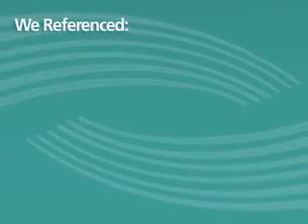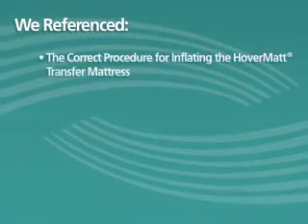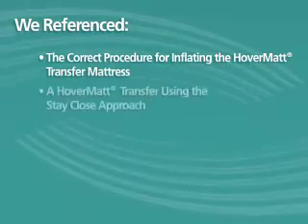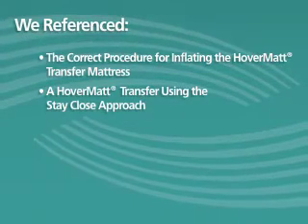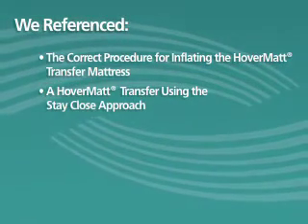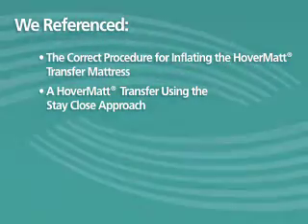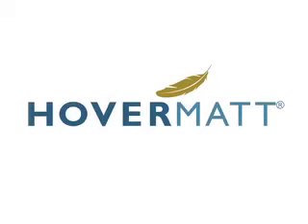In this section, we referenced the correct procedure for inflating the HoverMatt transfer mattress and a HoverMatt transfer using the Stay Close approach. Both techniques are explained in detail in the Using the HoverMatt Air Transfer System and HoverTech Air Supply video.